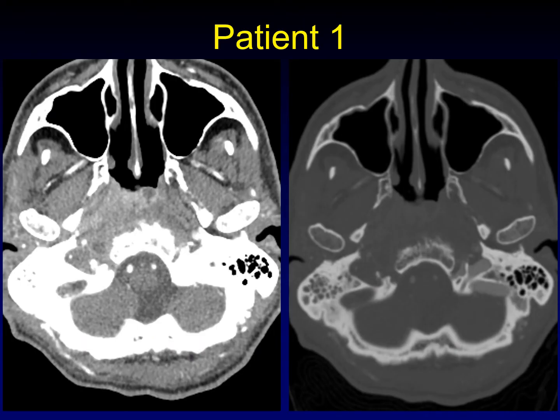This is patient one — an elderly man with a headache. You can see that there's a lot of fullness here just below the central skull base. And if you look at the bone window, there's a lot of erosions along the anterior clivus. This nice cortical rim has been disrupted.